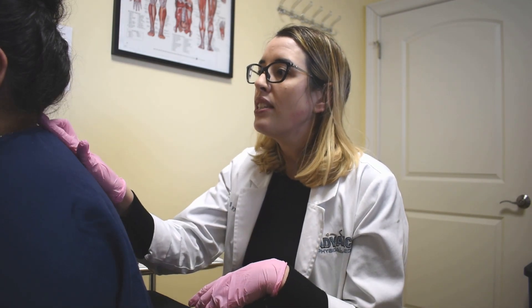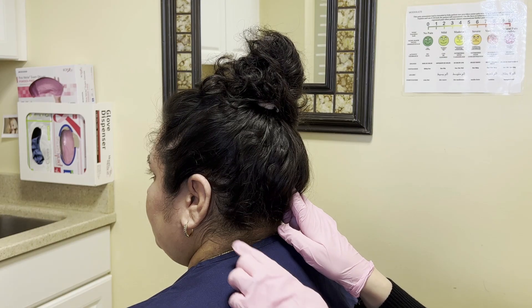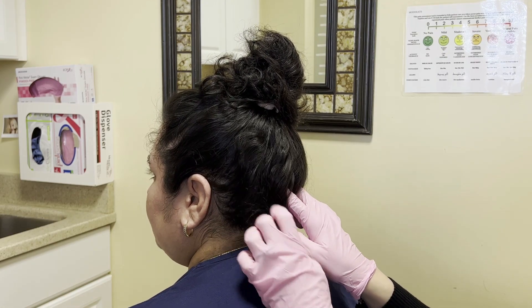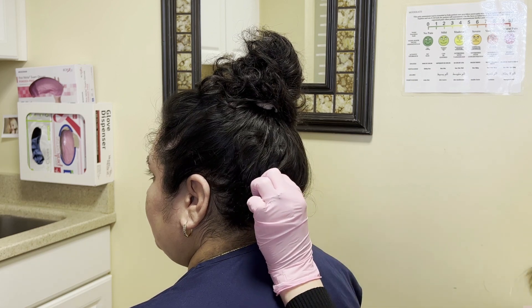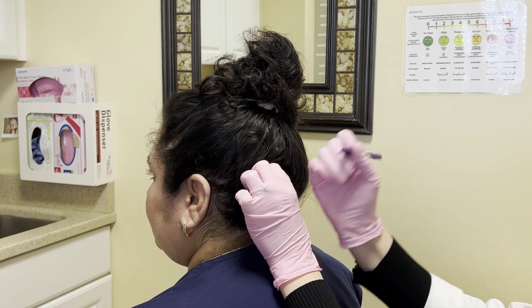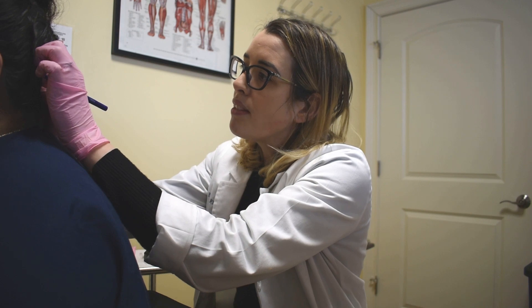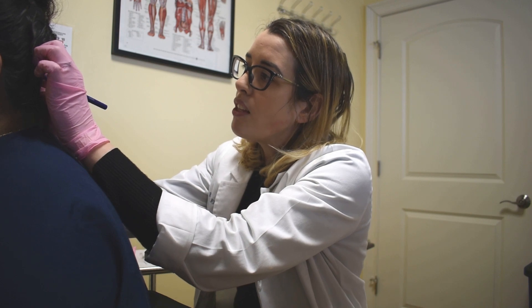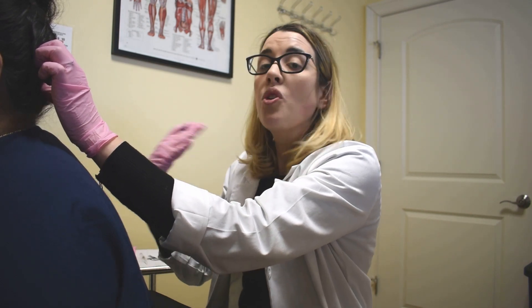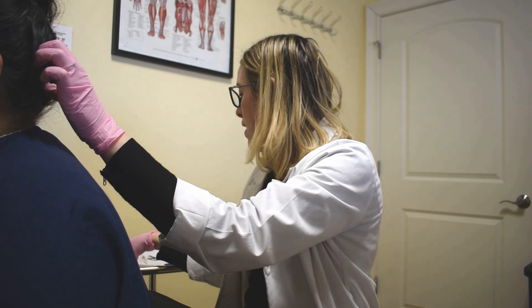All I need to do is identify my landmarks here to find where the nerve is, and essentially with these injections what we're doing is kind of like resetting the nerve so that it is no longer sending the sensation of pain to the patient.